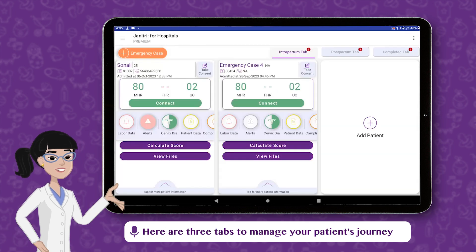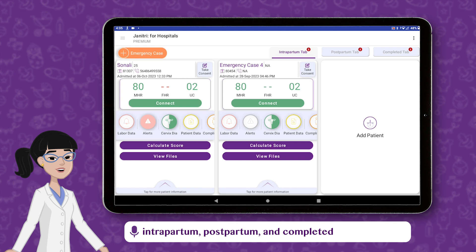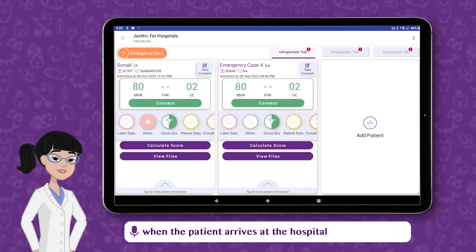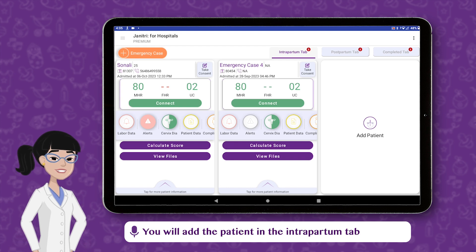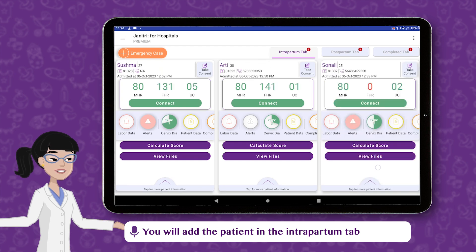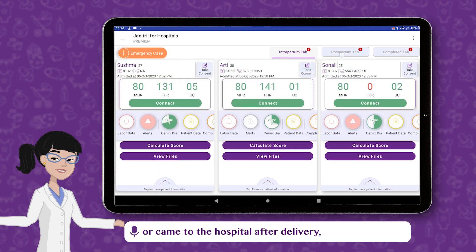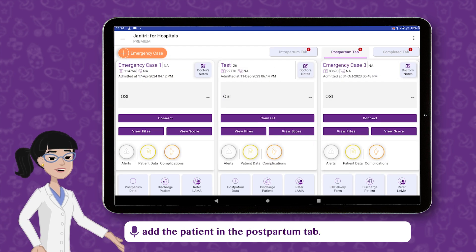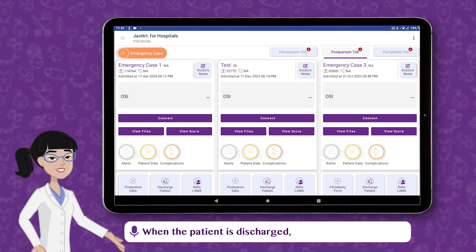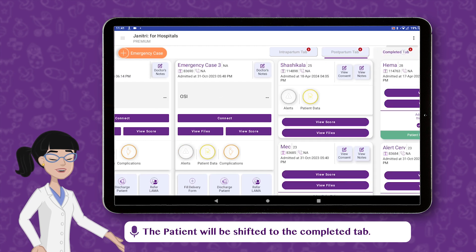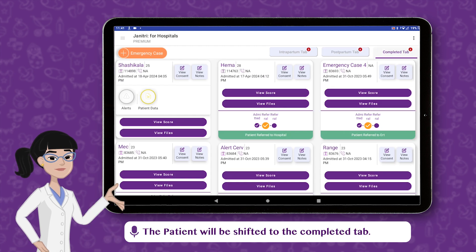Here are three tabs to manage your patient's journey: Intrapartum, Postpartum, and Completed. When the patient arrives at the hospital, you will add the patient in the Intrapartum tab. Once the patient has delivered or came to the hospital after delivery, add the patient in the Postpartum tab. When the patient is discharged, the patient will be shifted to the Completed tab.